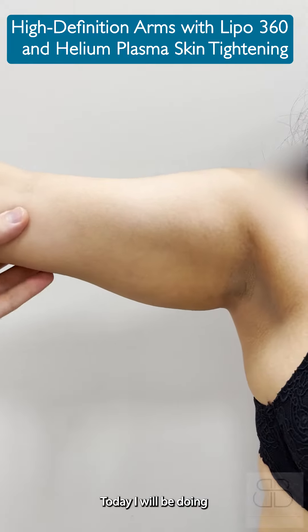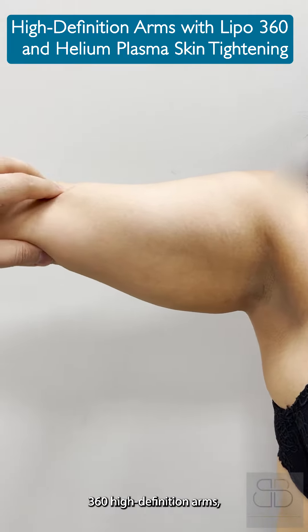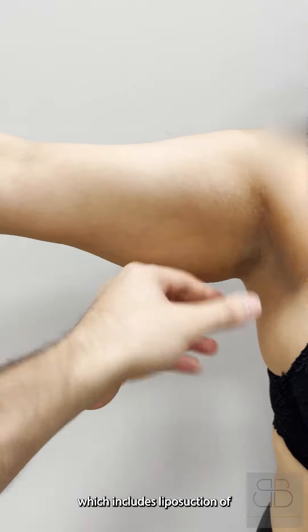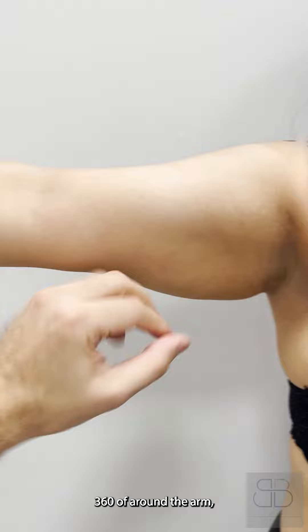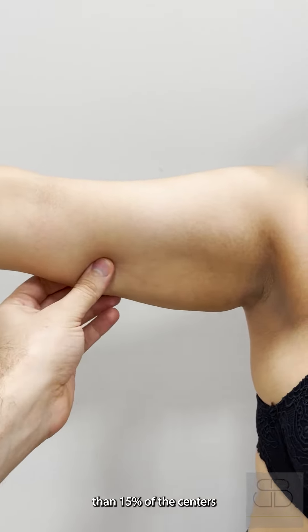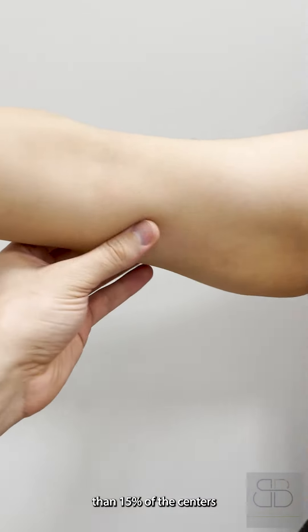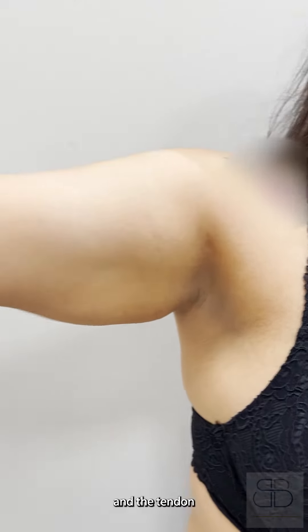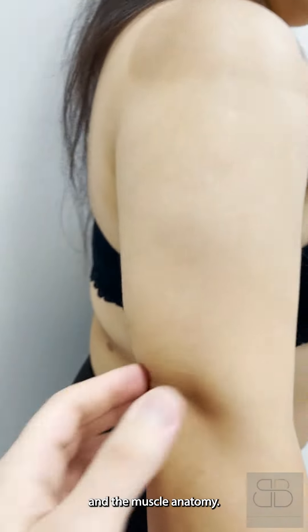Good morning. Today I will be doing 360 high definition arms, which include liposuction 360 around the arm. This is done in only about less than 15% of centers and requires more awareness of the anatomy, the tendon, and the muscle anatomy.